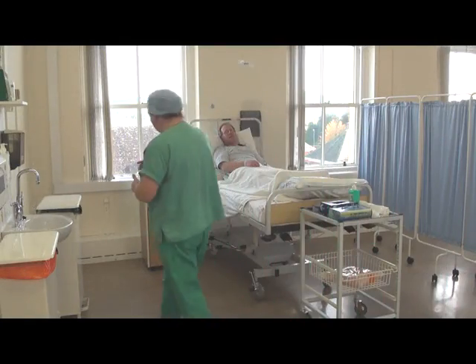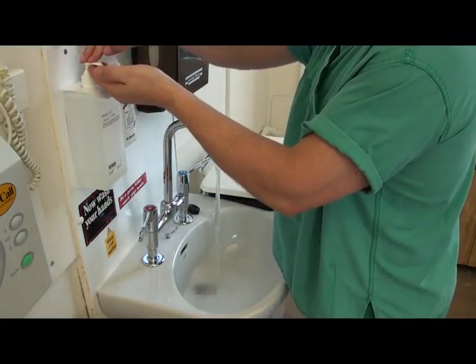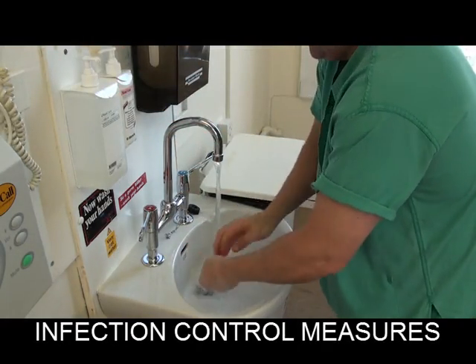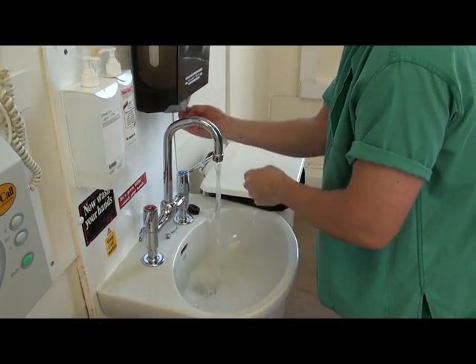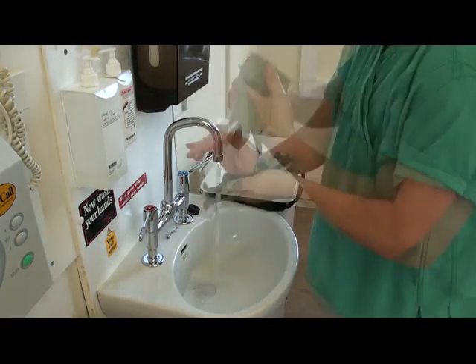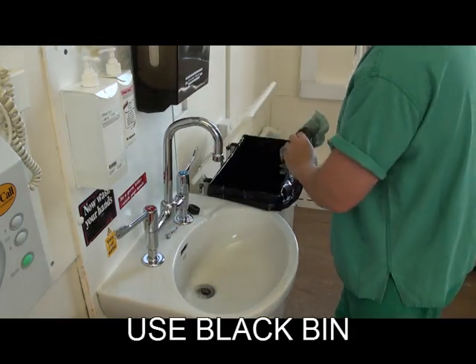On entering the patient zone, hands must be decontaminated before and after each episode of patient care. Liquid soap or antimicrobial hand gel should be used. At the sink, paper hand towels should be used to dry your hands and carefully disposed of into a waste bin.